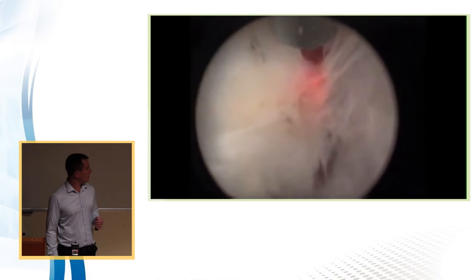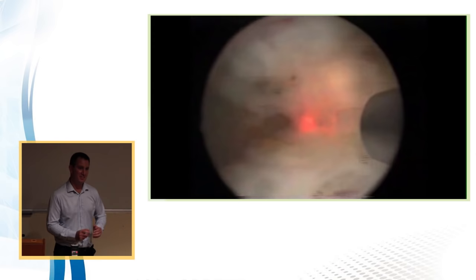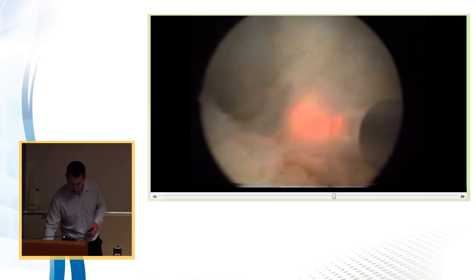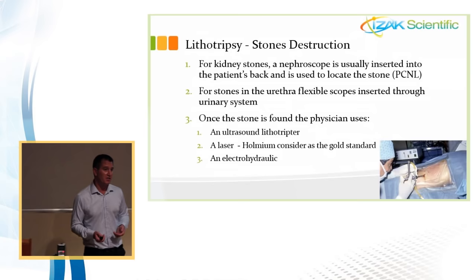Also, absorption inside the water: once you take the fiber and put it inside water, you hear it like a boom, boom, boom because of the bubble and the collapse of the bubble, which leads us to the next application. Once a urologic surgeon purchases a laser, he wants to use it for another application, which is stone fragmentation.